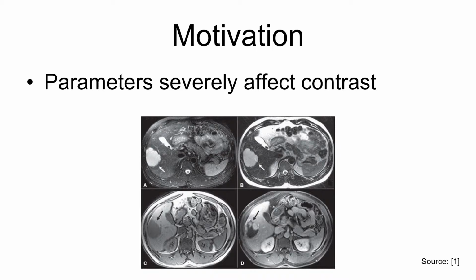The motivation of this project is that parameter choices are important to the reconstruction result. Different choices of TE, TR, and so on can largely impact the illuminance and contrast. From the image here, it can be seen that for thin sliced image, different parameter settings can make the image brighter or darker, and enhance or suppress contrast between tissues. Since tissues have different T1 and T2 values, and signal intensity is a function of T1, T2, TE, TR, and so on, adjusting TE and TR can manipulate contrast between two tissues.